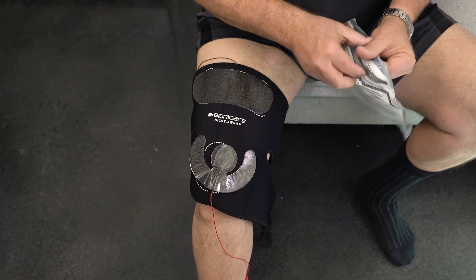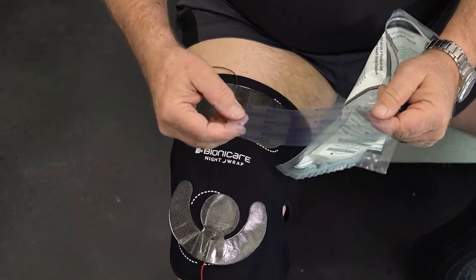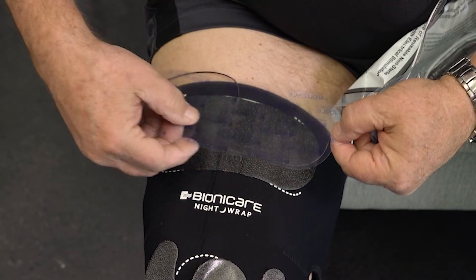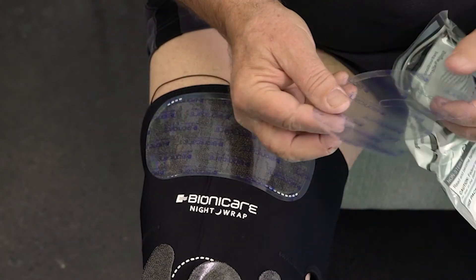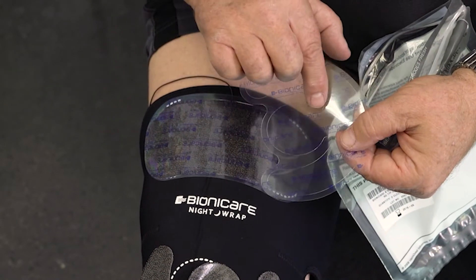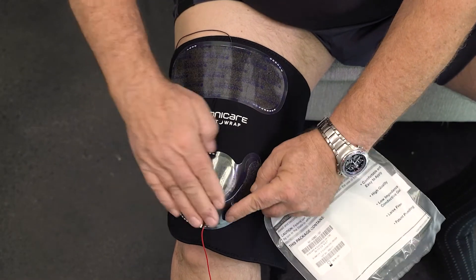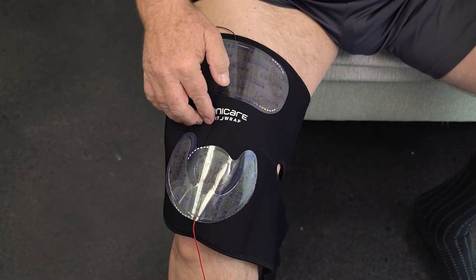Replace the clear plastic liners to keep the electrodes clean. Roll up the wrap.